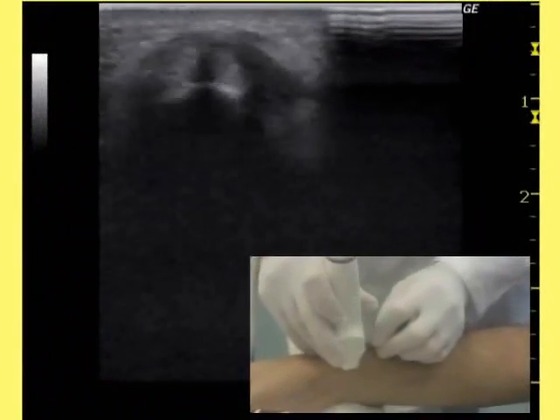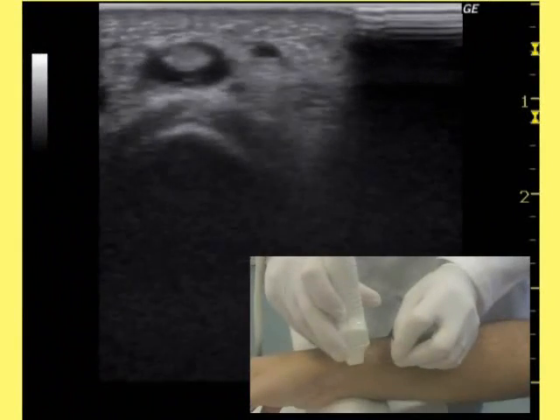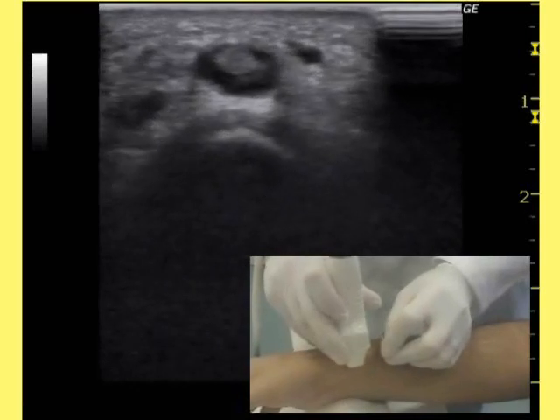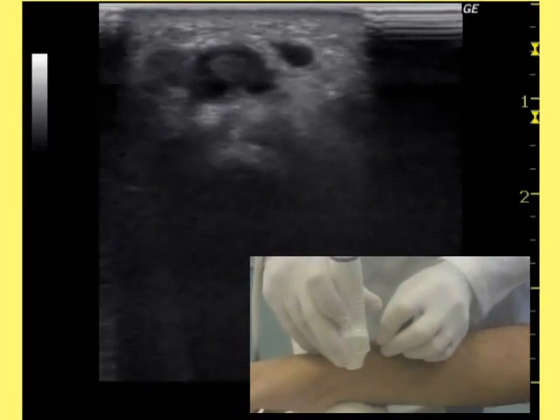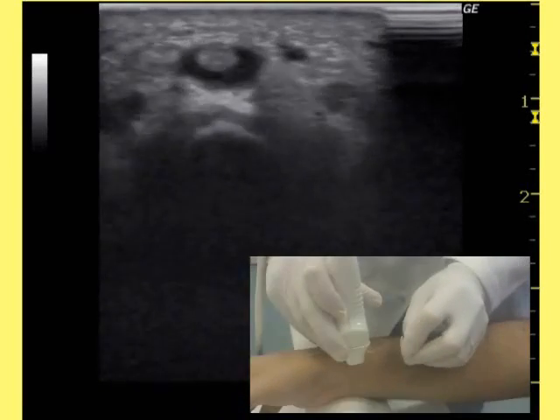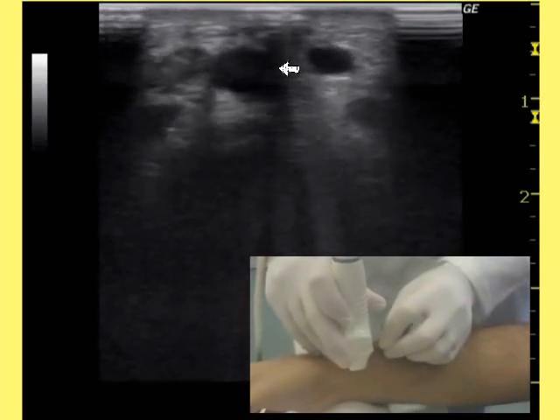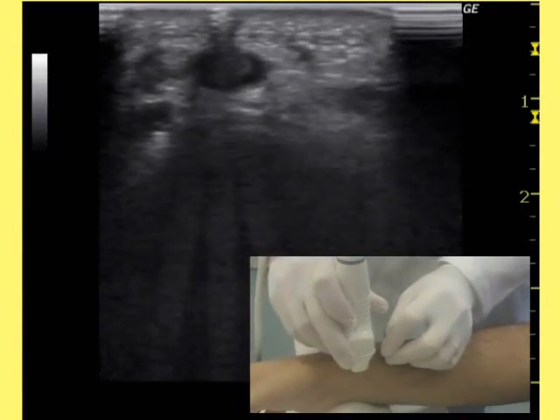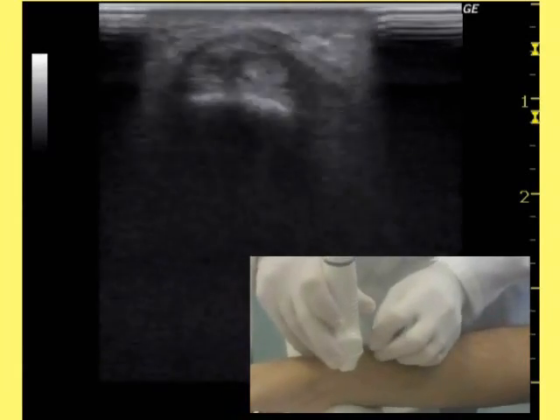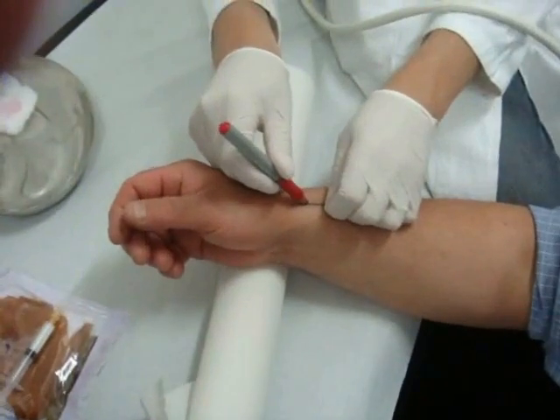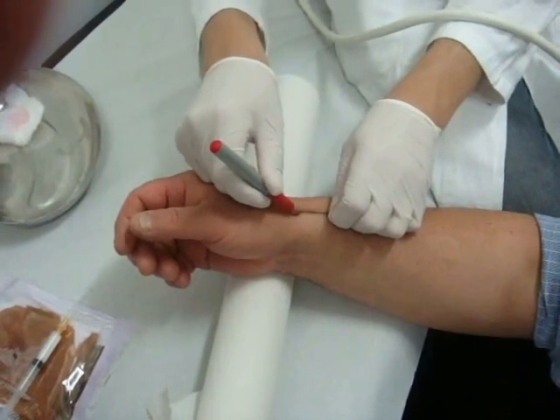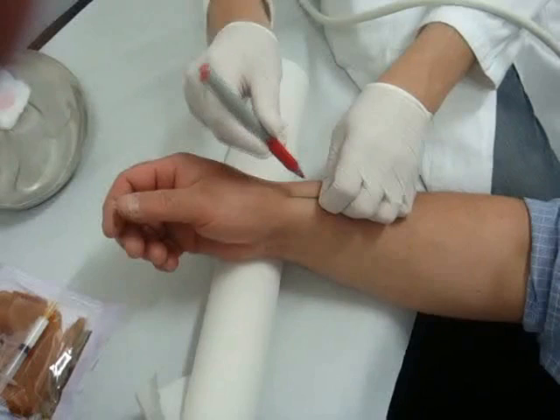The styloid process is then identified and the transducer is positioned over the skin perpendicular to the forearm's axis until the aforementioned tendons can be seen on the screen. A metal wire is placed between the transducer and the skin with its axis perpendicular to the surface of the transducer, until the artifact indicating its position can be localized on screen right above the considered tendon. The transducer is then removed and the wire profile is marked using a dermographic pencil.